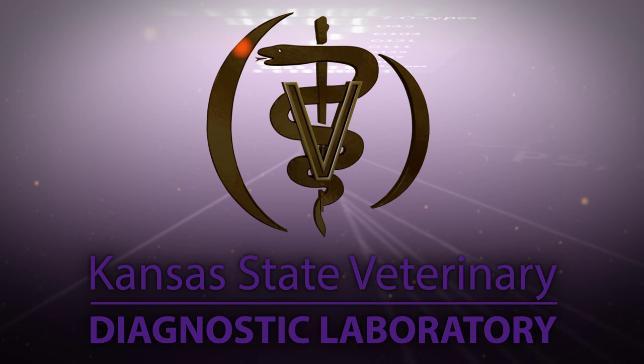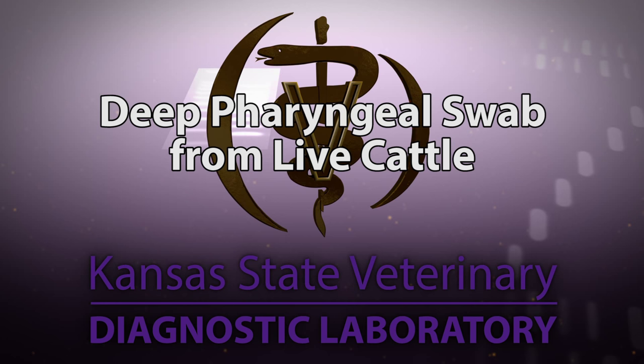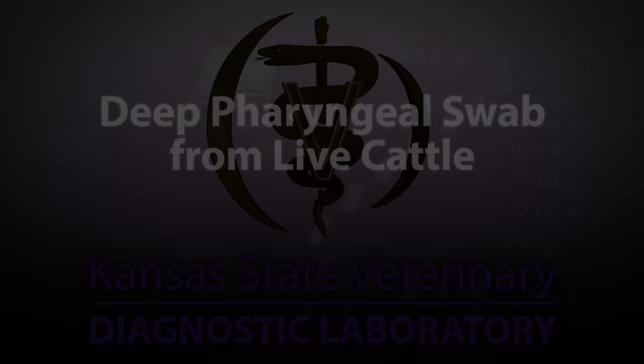Hello and welcome to the Kansas State Veterinary Diagnostic Laboratory YouTube channel. This video will demonstrate the procedure to collect a deep pharyngeal swab, also known as a deep nasal swab, from live cattle for PCR evaluation and/or bacterial culture.